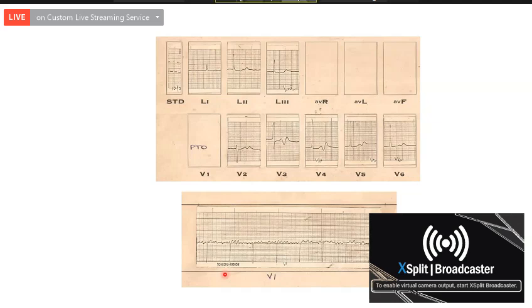What about the RR interval? Is it regular or irregular? Yes, the RR interval is regular, indicating that the patient has an associated complete heart block in a patient with atrial fibrillation. When the ventricular rate is regular, you have to consider that the patient has got a complete heart block and the ventricle is controlled by a lower focus, maybe at the junction or maybe at the ventricle. Here it is at the junction because there is a narrow QRS complex.